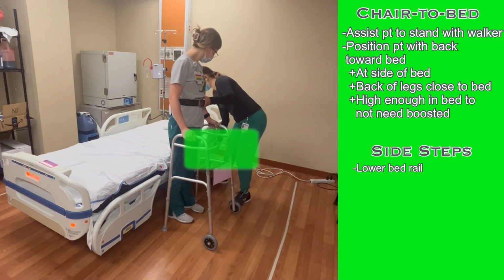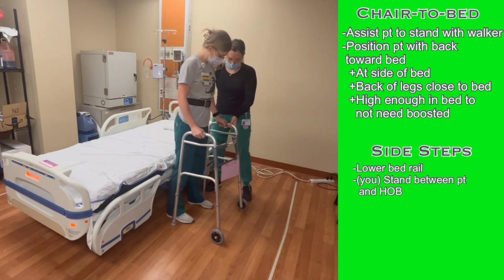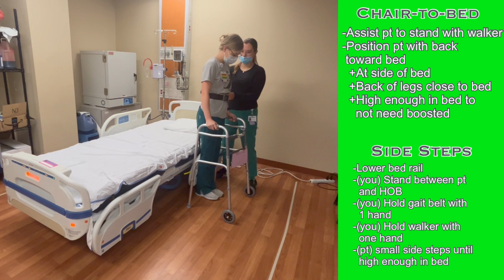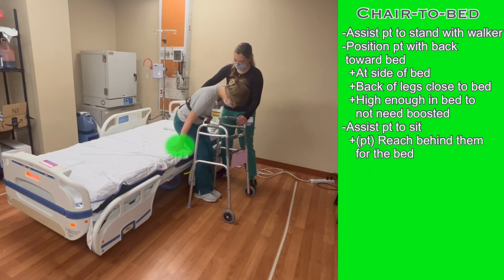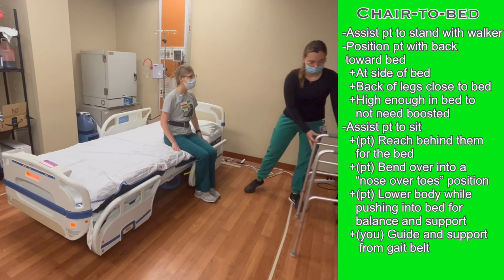Lower the bed rail. Have the patient take side steps toward the head of the bed. Stand at the patient's side, toward the head of the bed, and stand with a wide base of support, and you can support and guide the patient by holding the gait belt with one hand and stabilizing the walker with the other. Once the patient is close enough to the head of the bed, have them reach behind them to reach the bed. Have them bend forward with their nose over their toes and sit back, pushing into the bed for balance as you hold the gait belt and help guide and ease them onto the bed.